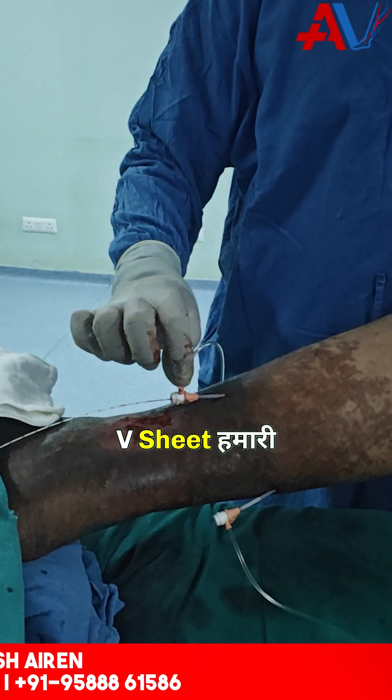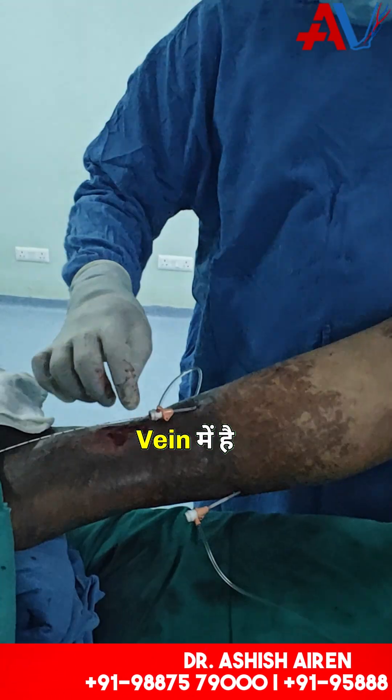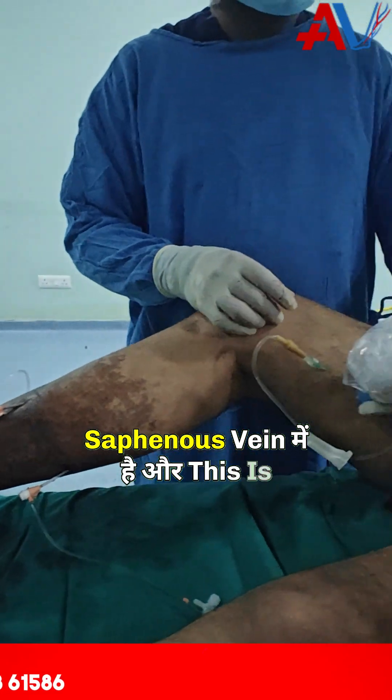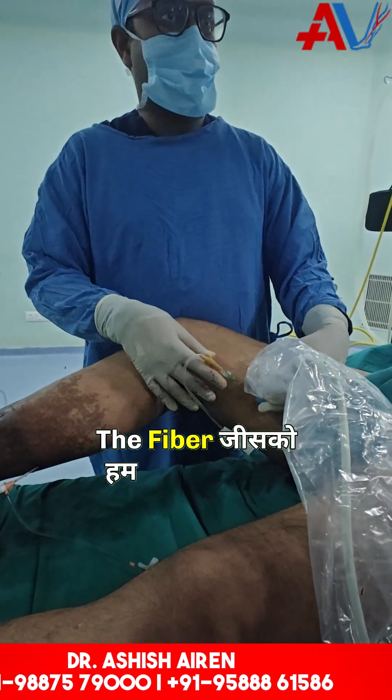This sheath is in the long saphenous vein. This sheath is in the short saphenous vein. This is the fiber we are observing.